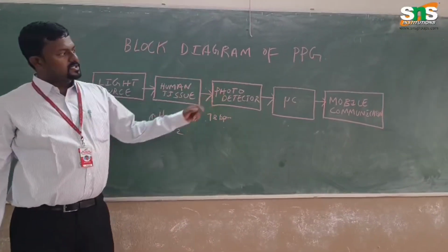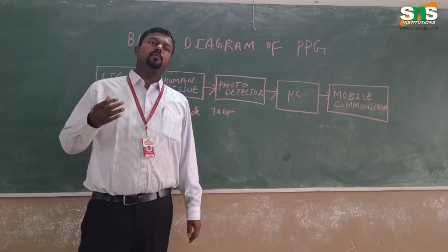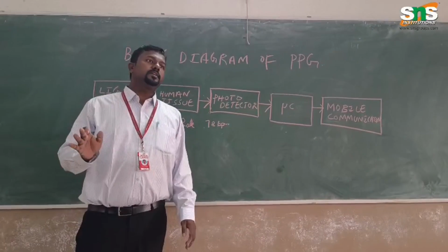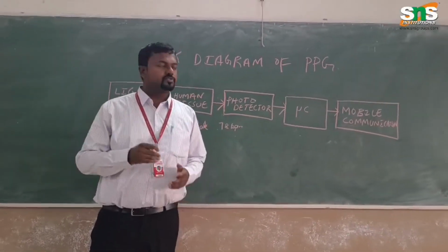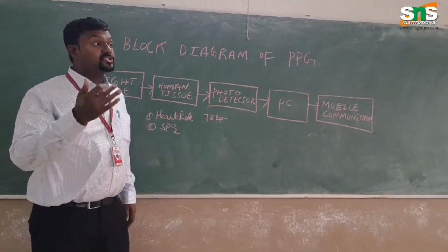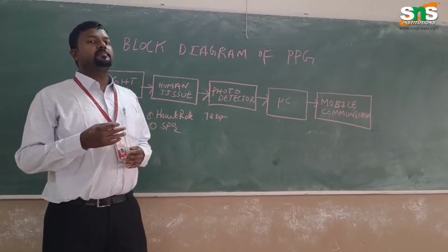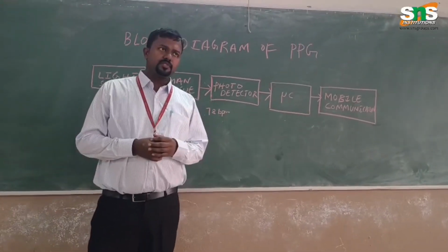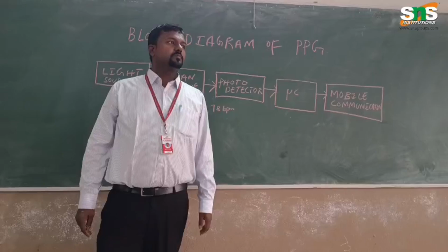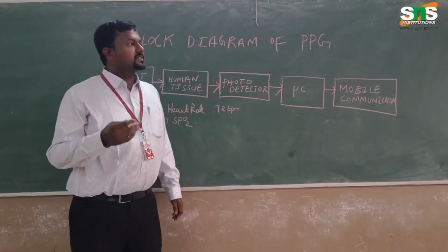The last term is mobile communication, because nowadays everything, whatever data, even not about the biomedical field or any field, the monitoring of signals is entirely done through smartphones only. The smartphone is, in other words, a diagnostic tool, because whatever signals are related to the sensors can be read through smartphones, because nowadays there is no one without a smartphone. So here the smartphone plays a role. The entire parameters of the PPG signal are stored inside the smartphone.